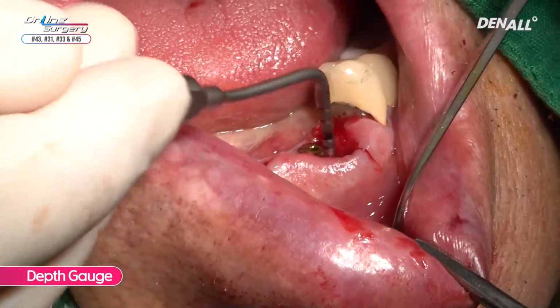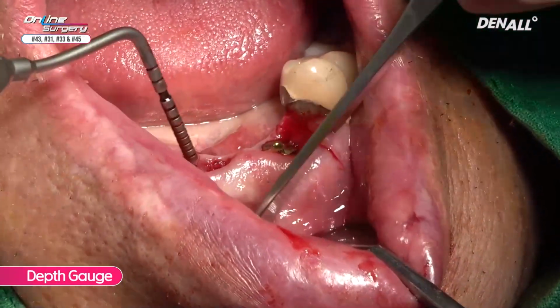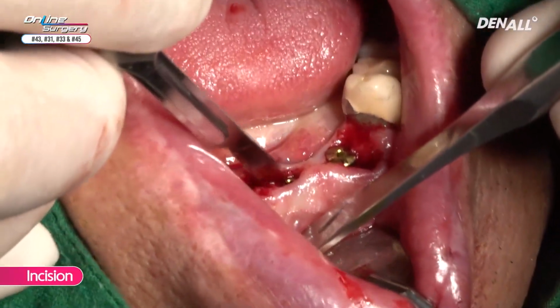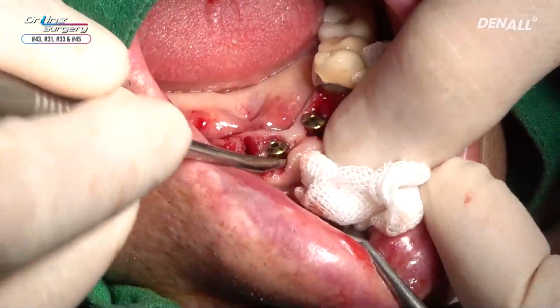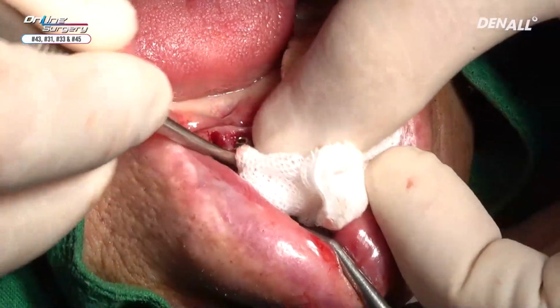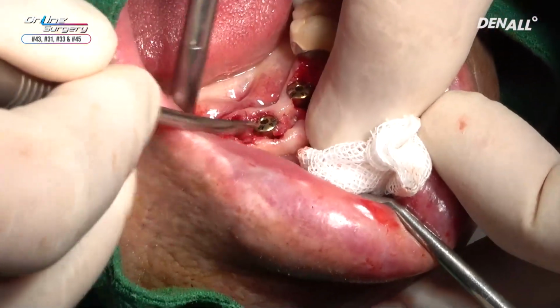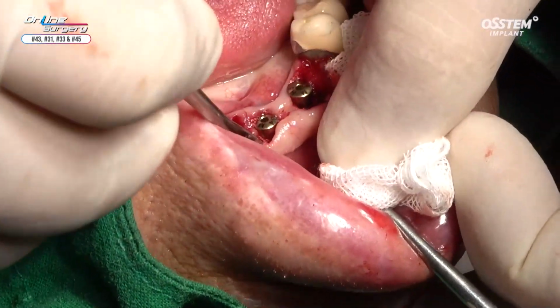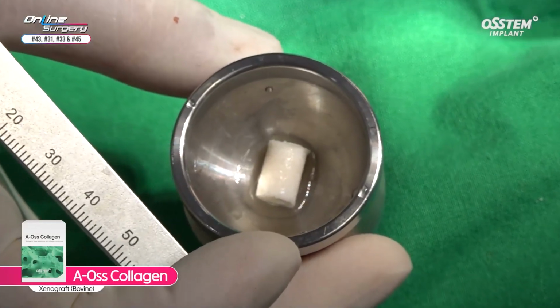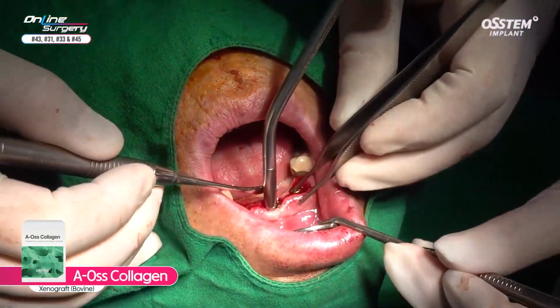So on here, because there were two roots, I'm going to do bone graft on the buccal side. Thread is not exposed. A-Oss collagen is bovine bone. Collagen 10% and bone is 90%. A particle is going to be placed.